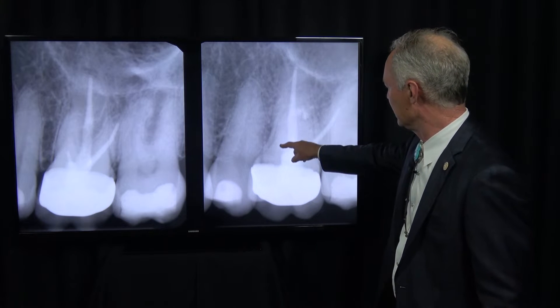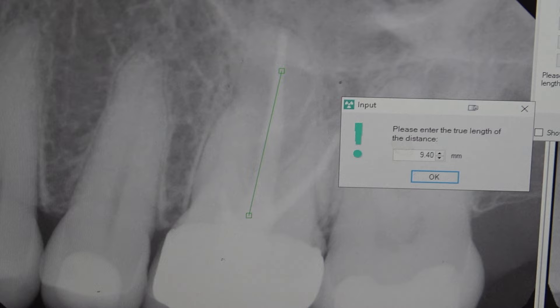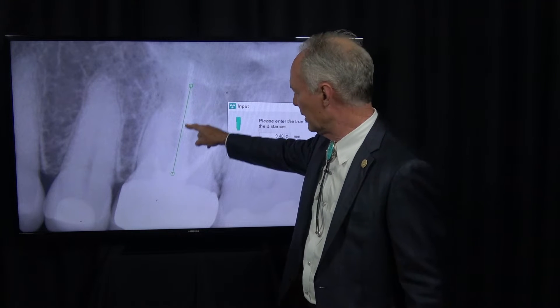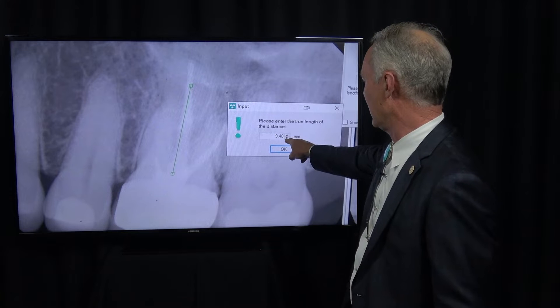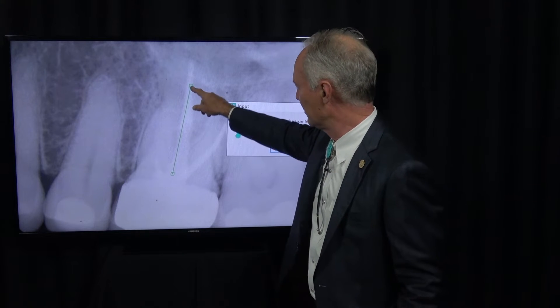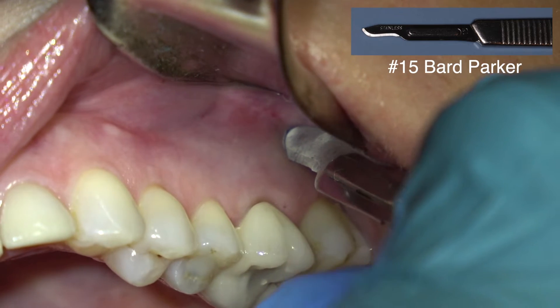Here's the final restoration — you can see the root curving over here and there's the retrofill. The first thing I'm going to do is measure the length of the root I'm performing the apicoectomy on from the margin of the crown. You can see that's about 9.5 millimeters, which orients me so I'm not working blind. I know that's about the length where I want to be making my ostectomy. This is a 15-blade Bard Parker.